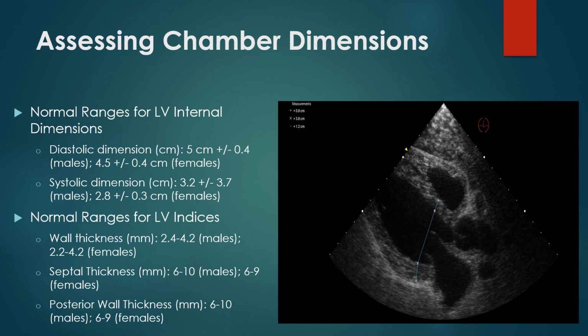And you think, well, God, man, that's too much information to remember. That's why you've got your FATE card. There's a little small foldable card you can stick in your shirt pocket, or else there's an app on your phone now that is very nice as well. And you can get these quick measurements if you even have a handheld. The handhelds can do this as well.